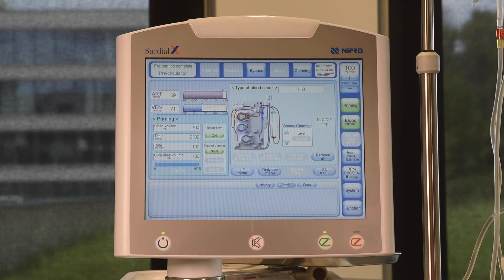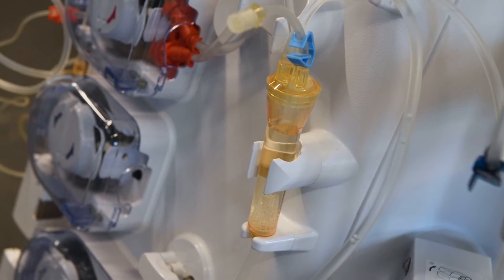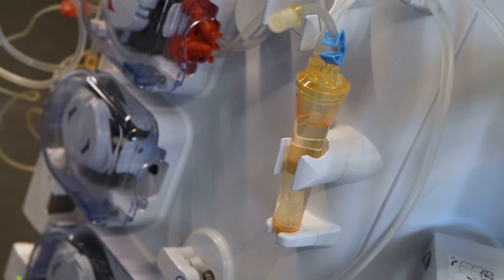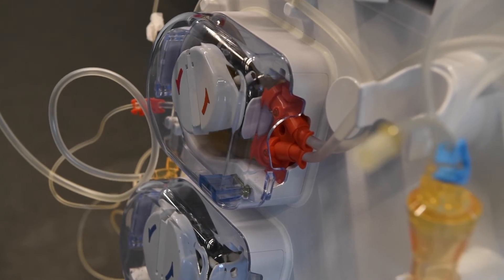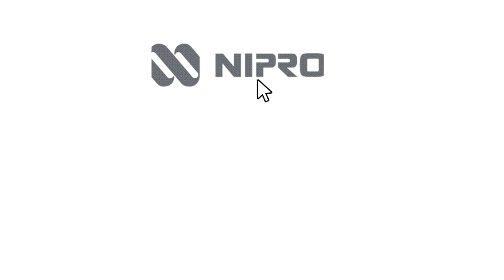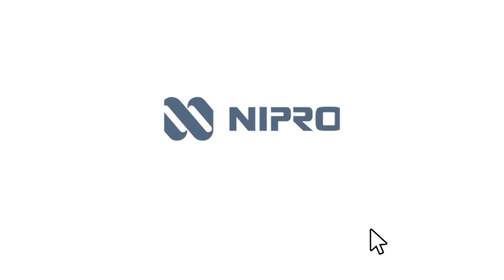When ready, press CIRCULATION START to begin circulation.